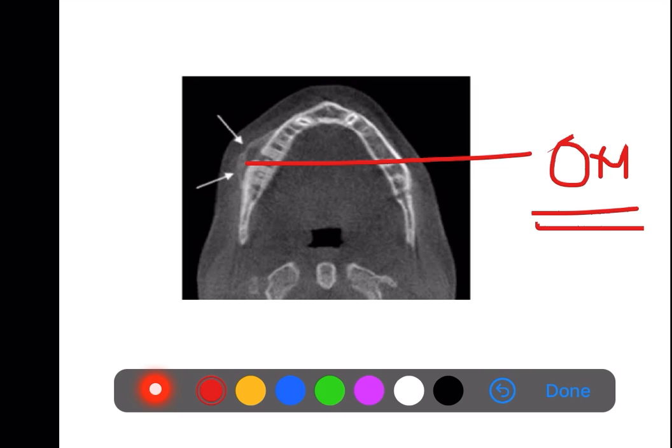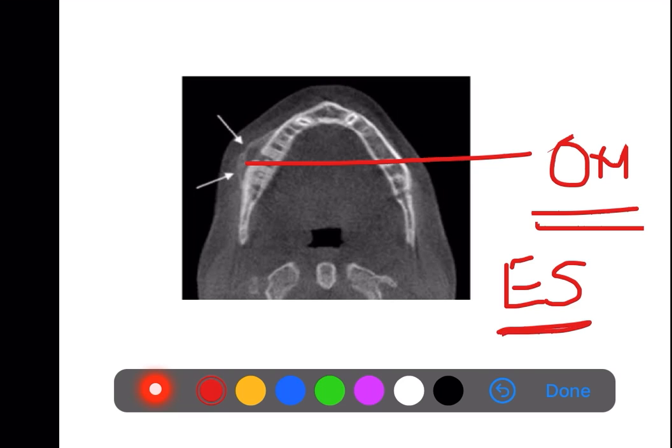Besides proliferative osteomyelitis, Ewing's sarcoma also shows this onion skin appearance. However, Ewing's sarcoma commonly occurs in children and very young adults, and the patient will complain of bone pain — not odontogenic symptoms. If the case involves a young patient or child with bone pain and no odontogenic origin, go for Ewing's sarcoma. Both conditions share the onion skin radiographic appearance, but the clinical findings differ, so you have to arrive at the diagnosis based on the clinical presentation.